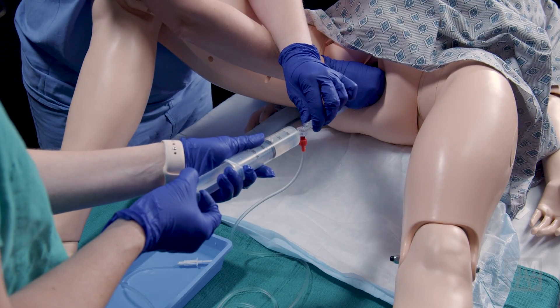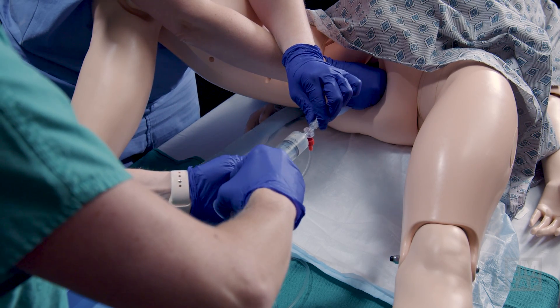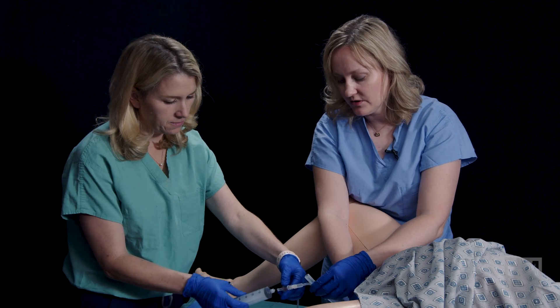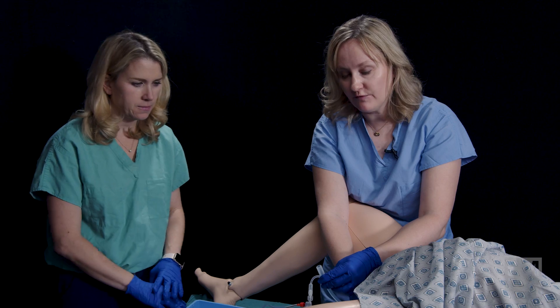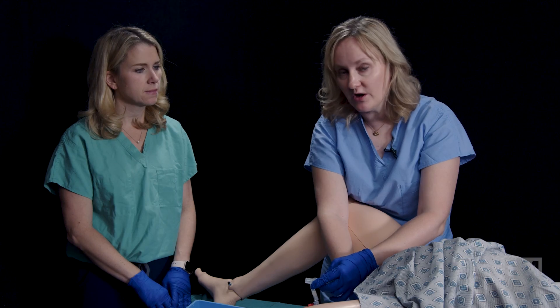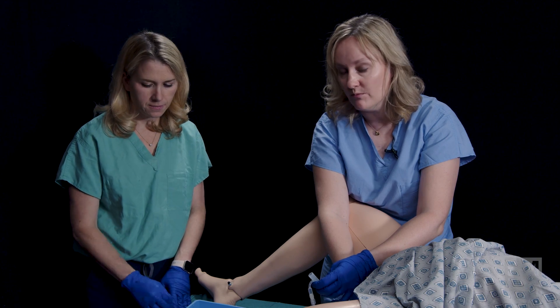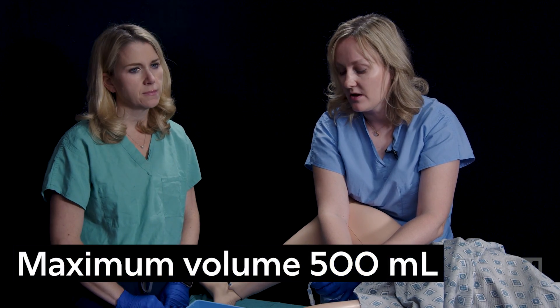Once you've instilled 350 mLs of fluid into the Bakri balloon, you're going to need to check for ongoing hemorrhage. To do that, I'm going to connect a Foley catheter bag to the port on the Bakri balloon. I'm going to look for ongoing hemorrhage, and with that Foley bag, I can actually calculate how much blood loss I've had. If there is ongoing hemorrhage, I'm going to continue to put more fluid into the Bakri balloon, up to a total of 500 mLs.